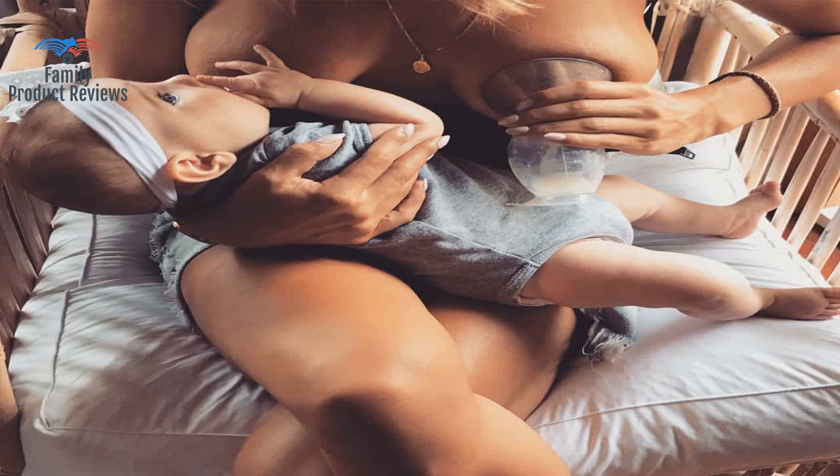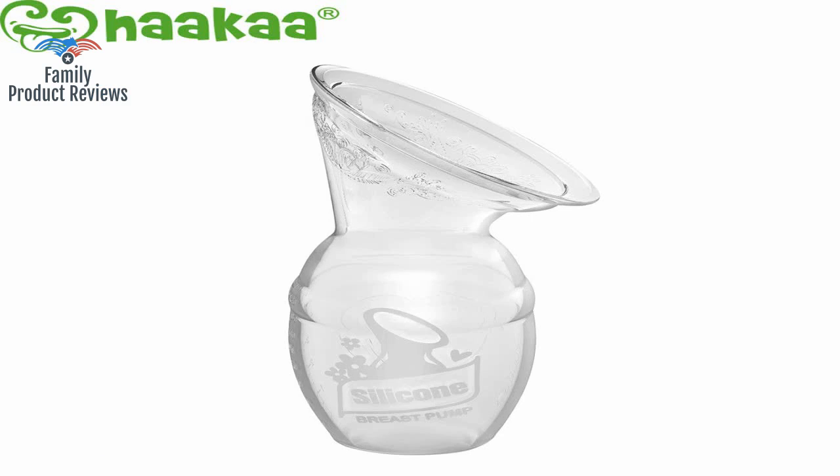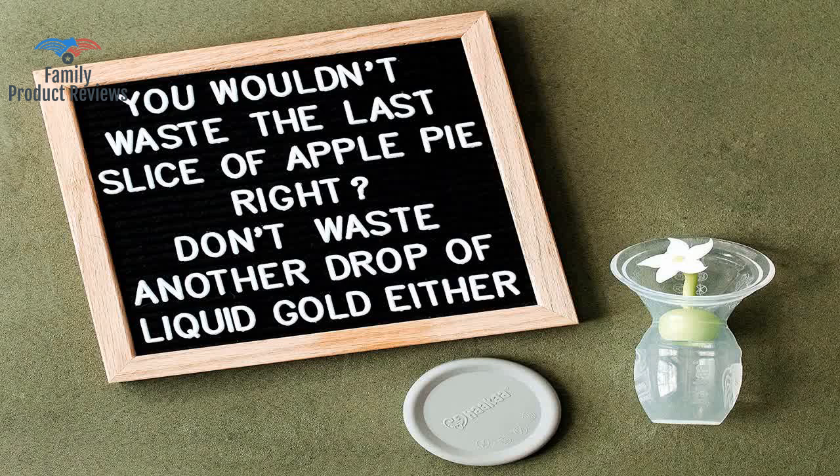Welcome to Family Product Reviews. If you are new here, support us by subscribing. Today we will be reviewing the Haakaa silicone breastfeeding manual breast pump milk pump — 100% food grade silicone, BPA, PVC, and phthalate free.